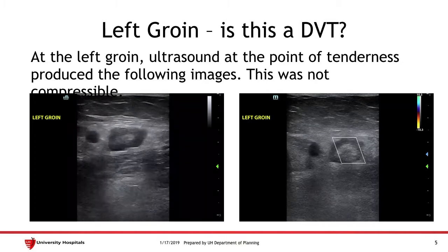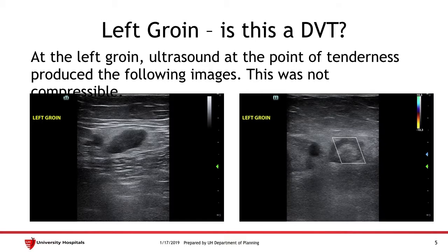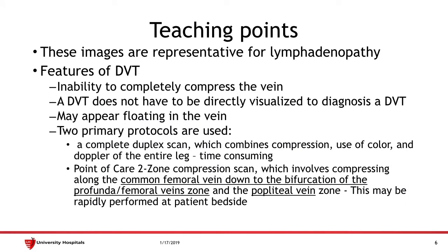I then proceeded to ultrasound the left groin where she was having tenderness and found the following images. On the right image, this was during compression attempts and it did not appear to be compressible. Which brings us to our question: is this a DVT, and is the object in the center a visualized DVT? The answer is no — these images are actually representative of a lymph node with lymphadenopathy.